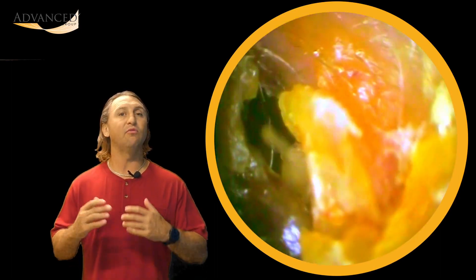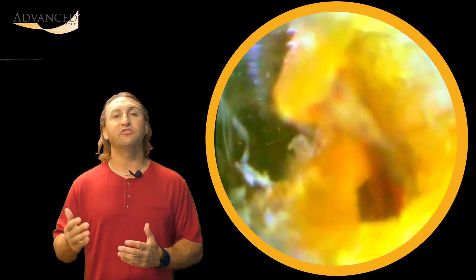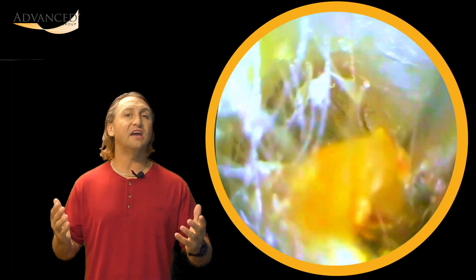Now we're gonna jump to this patient's other ear. They have collapsing canals on both sides. This is not always the case. Sometimes people will have one ear canal that's collapsing or very narrow, and one that's much more open and natural. In this case, the patient has collapsing canals on both sides.